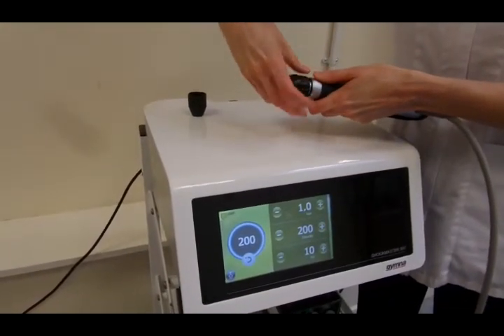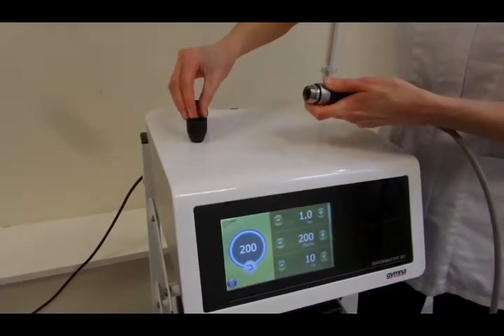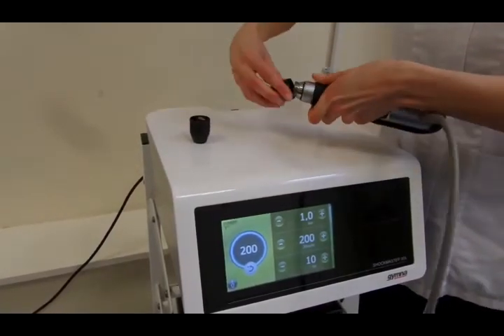Today we'll be treating chronic supraspinatus tendinitis and calcific supraspinatus tendinitis with the Gymna ShockMaster 300.